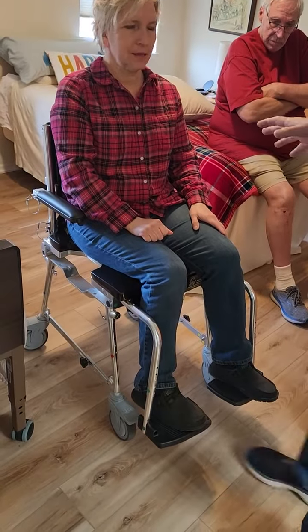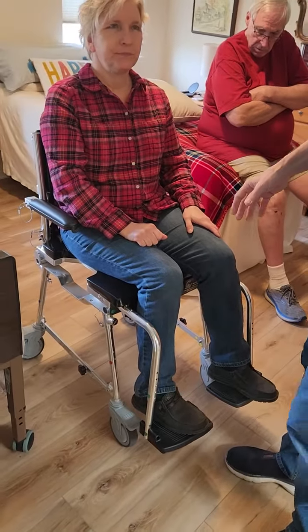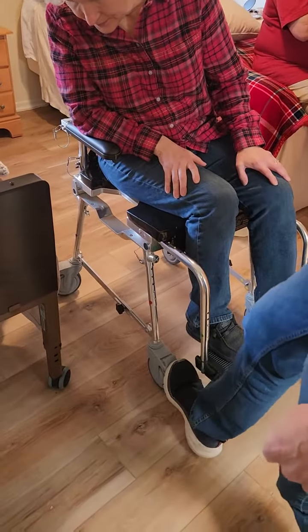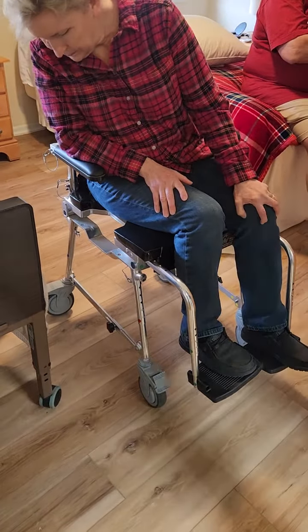First we're going to demonstrate the components on the shower transfer chair. It has locking feet — all four of the caster wheels lock by pressing down. That's the lock position when that tab is sticking up.